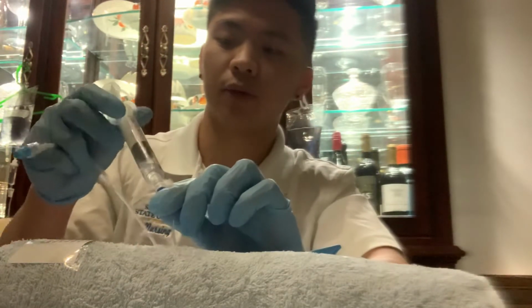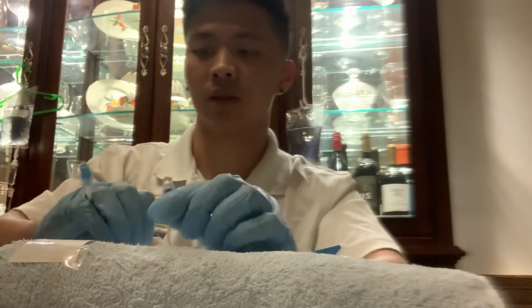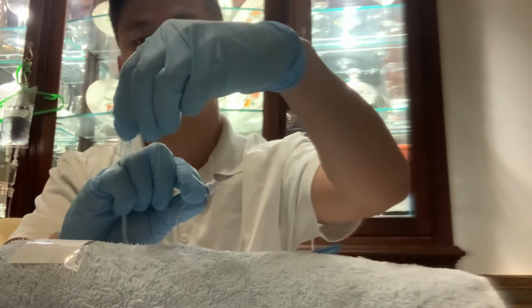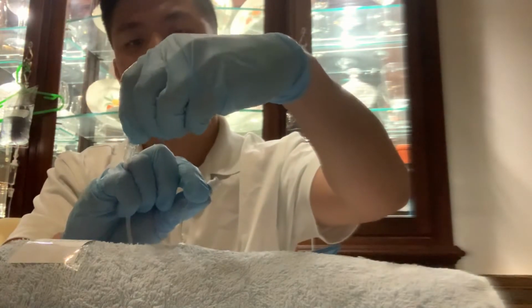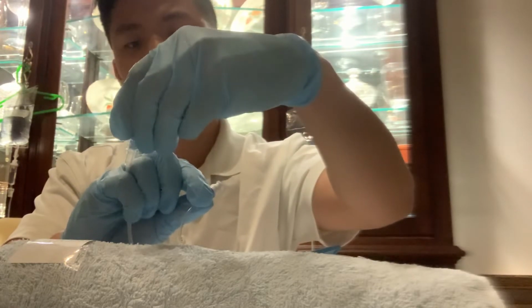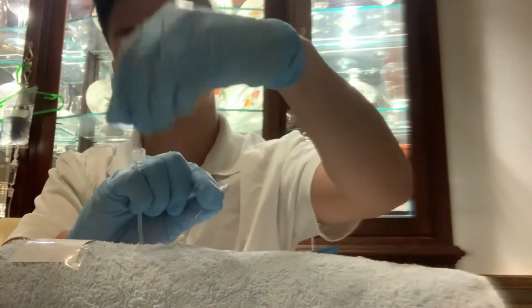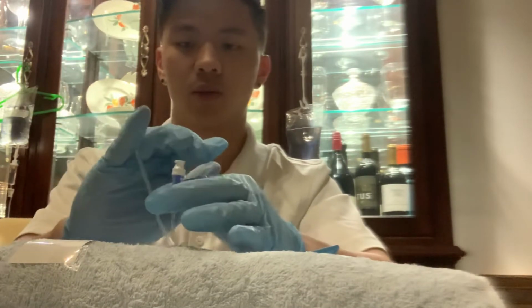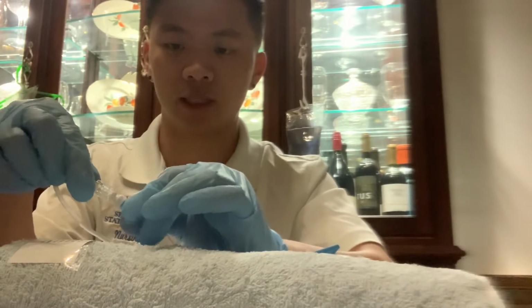After that, I'm gonna go ahead and remove the saline flush. Now I'm gonna go ahead and cap this. This is the end of the primary tubing, sterile end. Go ahead and remove the cap. And I would go ahead and attach it to the saline lock.